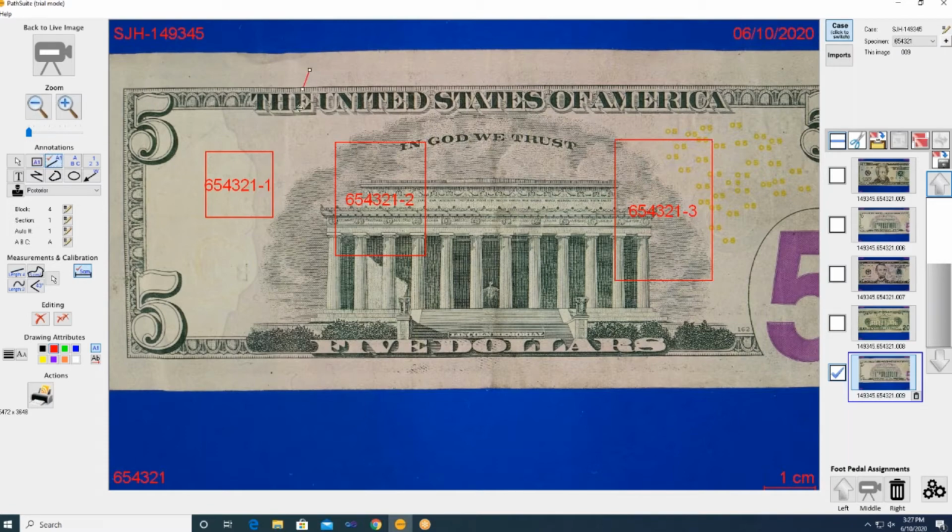We also can draw basically section lines, and it auto labels. Here's -1, -2, and that way you can call out those sections within your dictation. If you want to label things or count with letters, you can count with letters. You can count with numbers. And if you would like to draw blocks in a whole different way because they're not exactly square, you can go to your heart's desire and make them polygon. Or if you want to just draw freehand, you can do it that way.